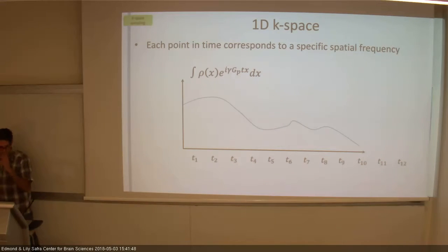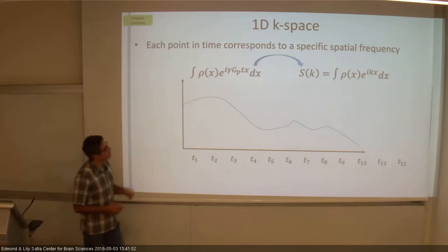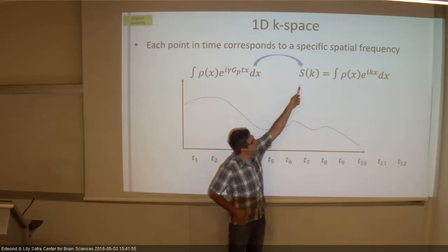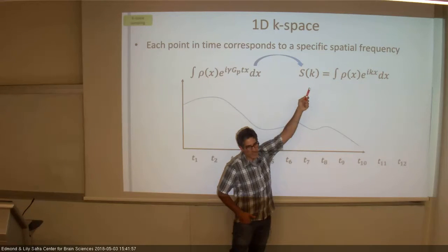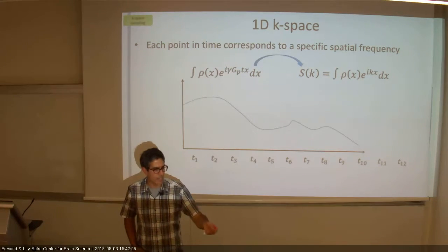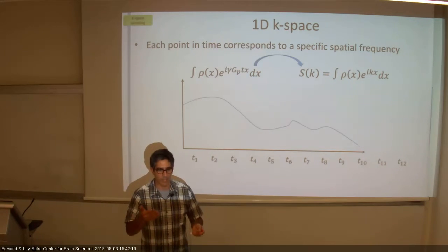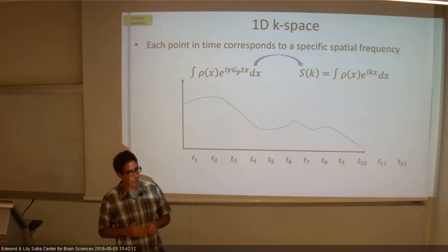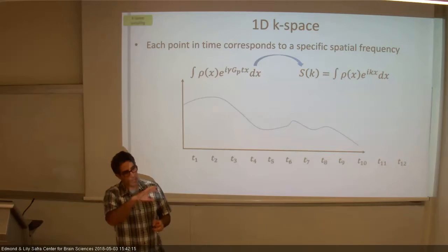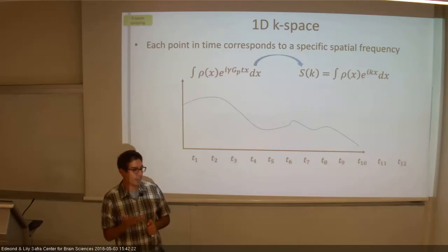And this is basically it. So we have a time series that we measure, but it's actually the weight of the different frequencies in K space. That's the thought. So I'm measuring this line in K space, this line in K space, different positions in K space. I have the weight on that, weight on that, weight on that. And now when I have the weight of all the positions in K space, I can do the Fourier and say, oh, this is the image. When you say weight, do you mean the amplitude? Yes, yeah.